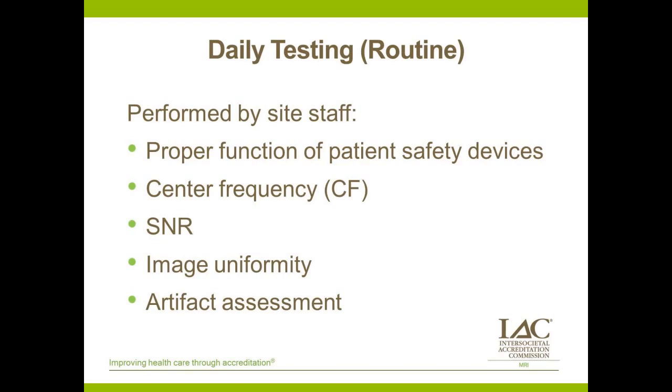In addition, sites are required to perform any other tests that are recommended or required by their MRI manufacturer, and this will vary based on different MRI manufacturers, different models. Different manufacturers will have different test intervals, so they may require certain tests to be done on a weekly basis, monthly basis, etc. Sometimes they're spaced out as infrequently as quarterly or semi-annually.